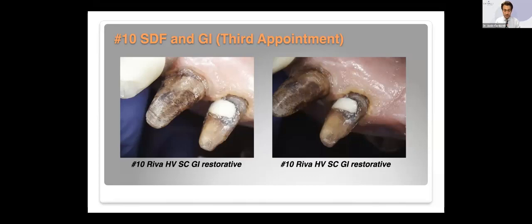And I talked to the patient and I said, at this time, I think the decision would be good to use a glass ionomer cement in this case, because you're going to remineralize and regenerate and boost that SDF that's there too. She was a little concerned about using a final cement on it, but I told her, if something goes wrong again on this, we're going to have to look at alternate treatments. And I don't know if we can save this bridge for that long. And the benefit from the fluoride from the glass ionomer cement, I think is really going to help her. So she understood.